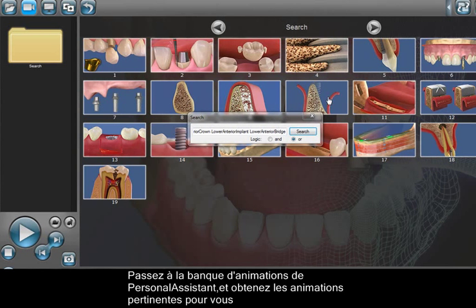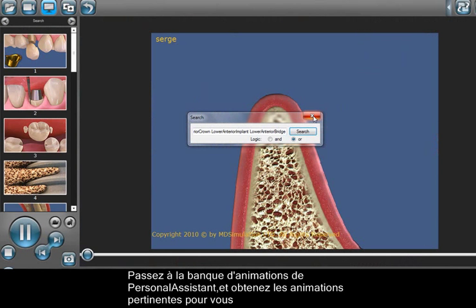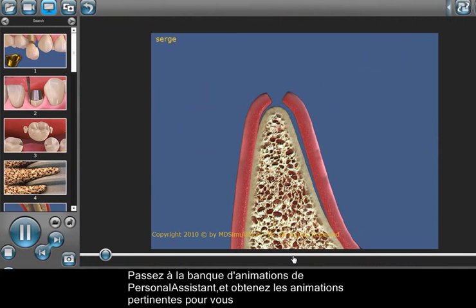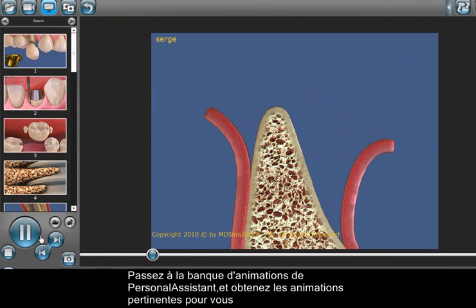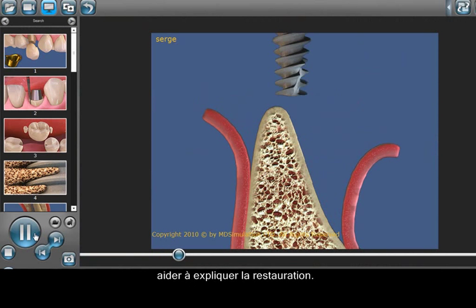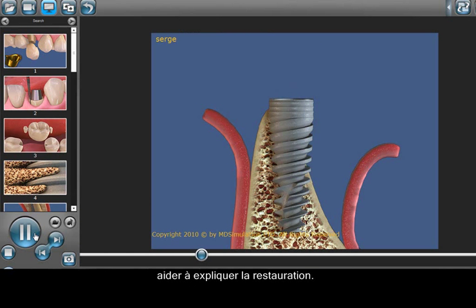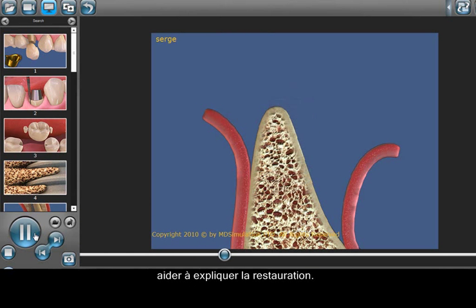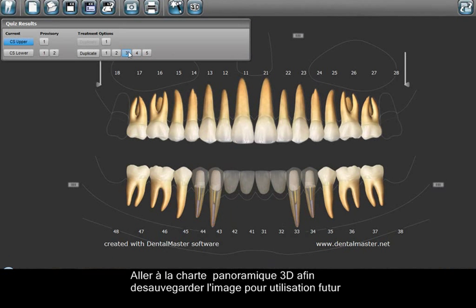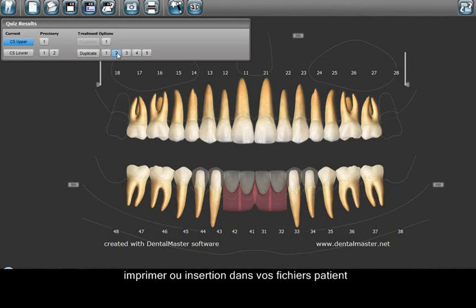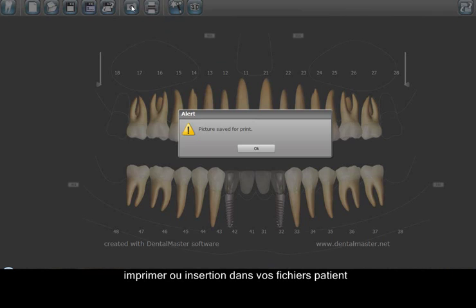Jump to the Personal Assistant Animations Bank and get the relevant animations according to the restoration to assist with your explanation. Jump to the 3D panoramic chart to save the case picture for later use, such as print or insert in your patient's data files.